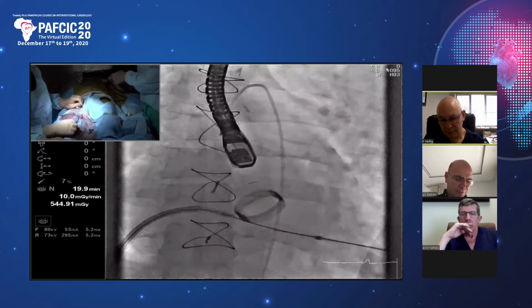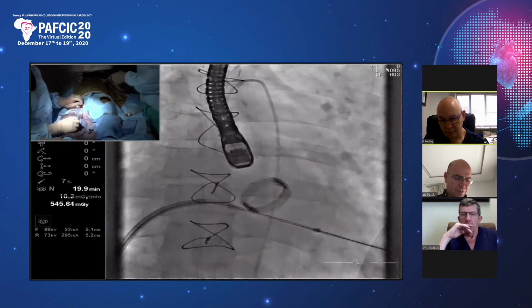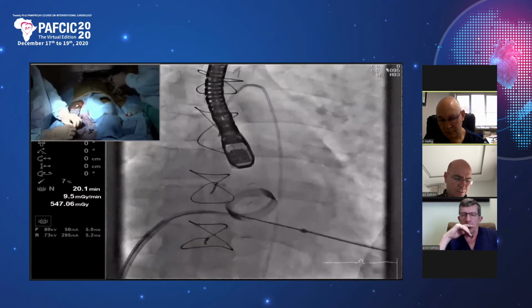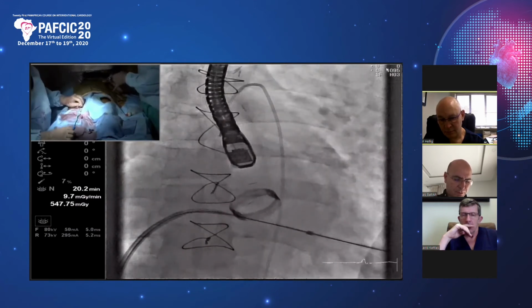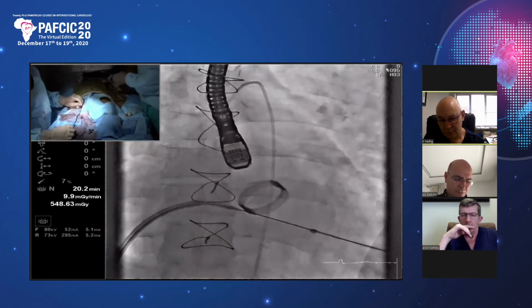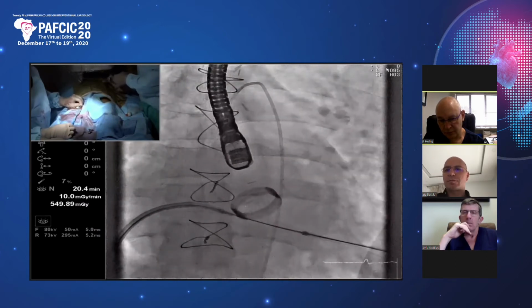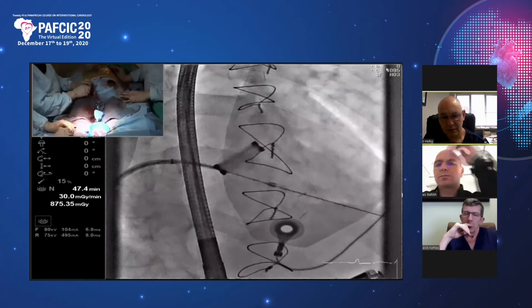I can't cross. If you're having trouble crossing, does that have some implications for whether the device is going to impact on the mitral valve itself? Yes, it may be a relevant factor. We've got so much of a rail here. I must say I wouldn't have anticipated difficulty crossing. You can see the difficulty. I can feel the whole system rocking like crazy. So I think we're going to have to change strategies and go with smaller sheaths. See, even the dilator doesn't go.